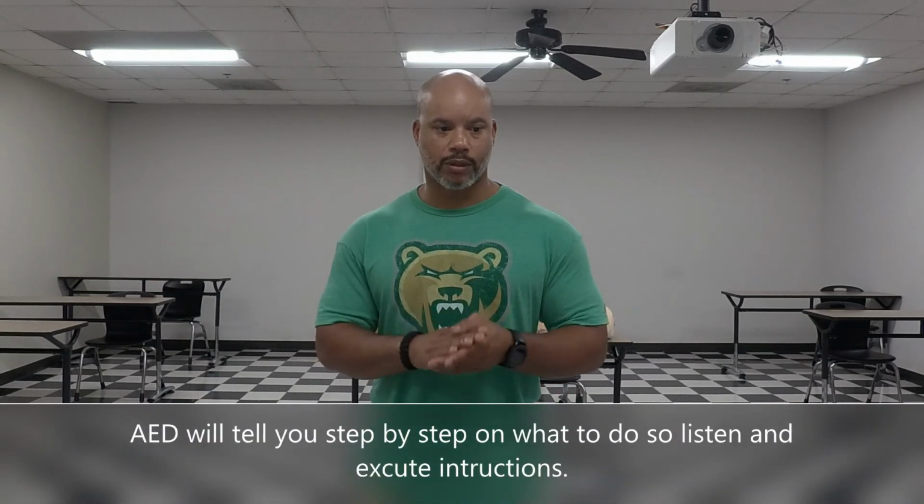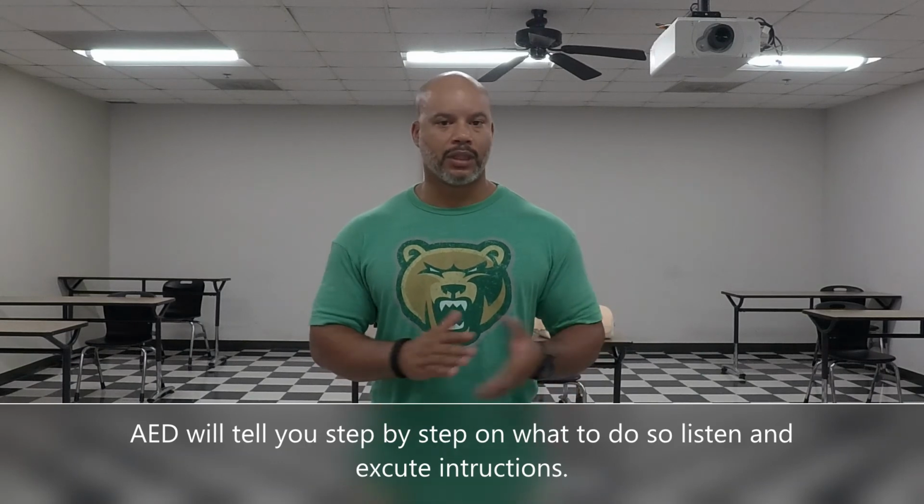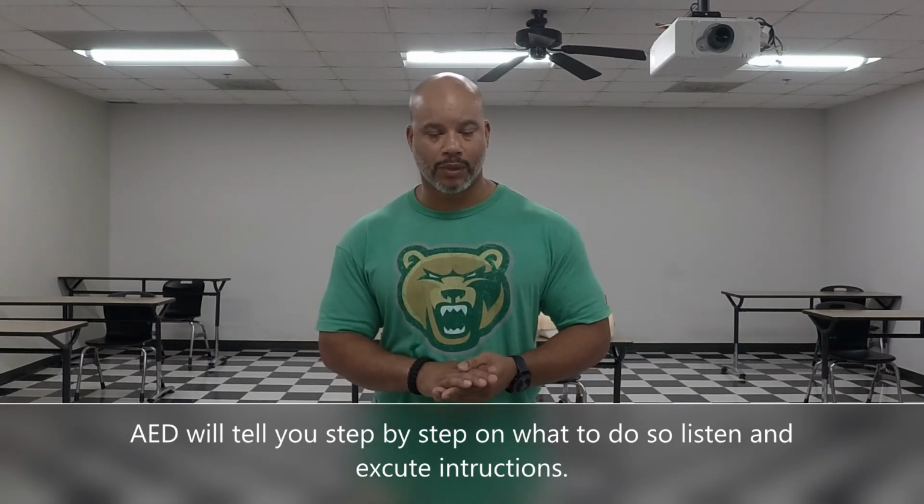The AED is vital because it's the only external thing that actually gets the heart back to its natural rhythm. The AED is automated. It will tell you everything you need to do. You just follow the voice prompts and do things as instructed with the AED.